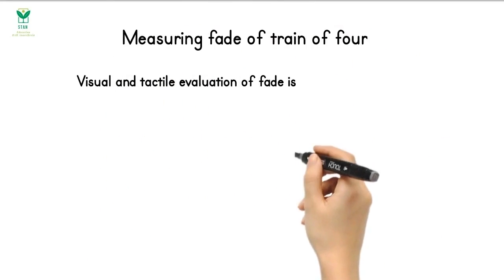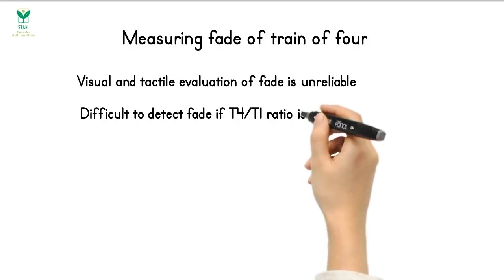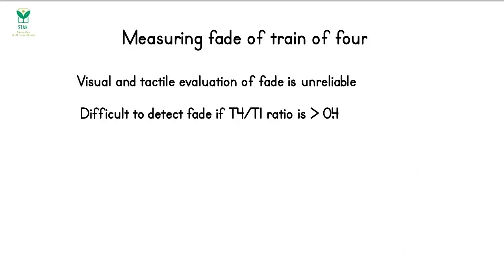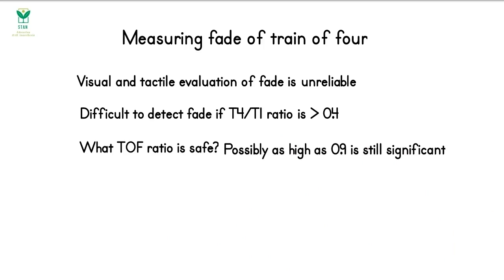Visual and tactile evaluation of fade is unreliable. It's been shown to be difficult to detect fade at all if the ratio of T4 to T1 is more than 40%. There's also the question of what train of 4 ratio is safe, i.e. at what point would you not feel it necessary to reverse further. And it may be that a T4 to T1 ratio of 0.9 is still demonstrating significant muscle weakness.